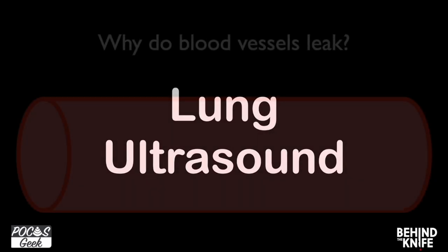So one item that we can use ultrasound to assess when determining fluid responsiveness is lung ultrasound. Now, lung ultrasound itself will not predict fluid responsiveness, but it can be a way of monitoring if we can get fluids or when we should stop. And so I want to talk about that briefly here for a moment. I often use this in conjunction with cardiac ultrasound in my critical patients, and so I'm already doing this, and it gives me an idea of how to move forward with them.